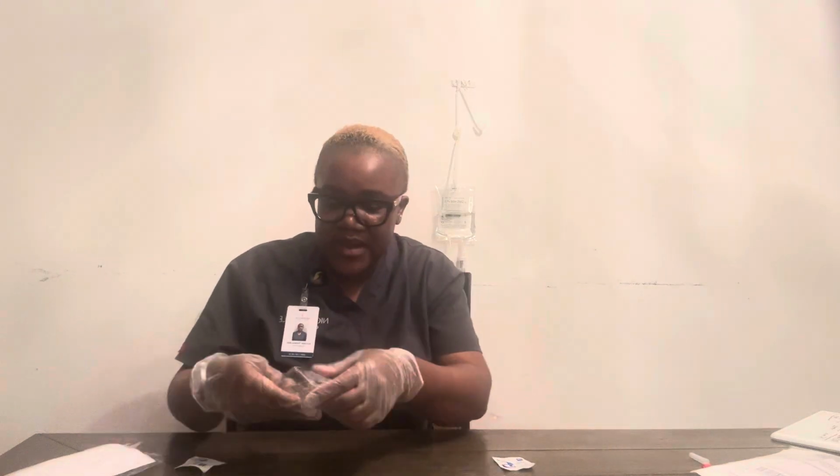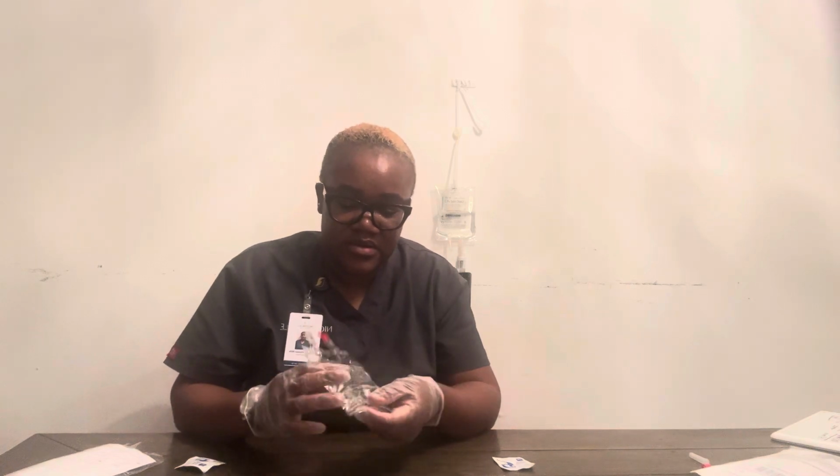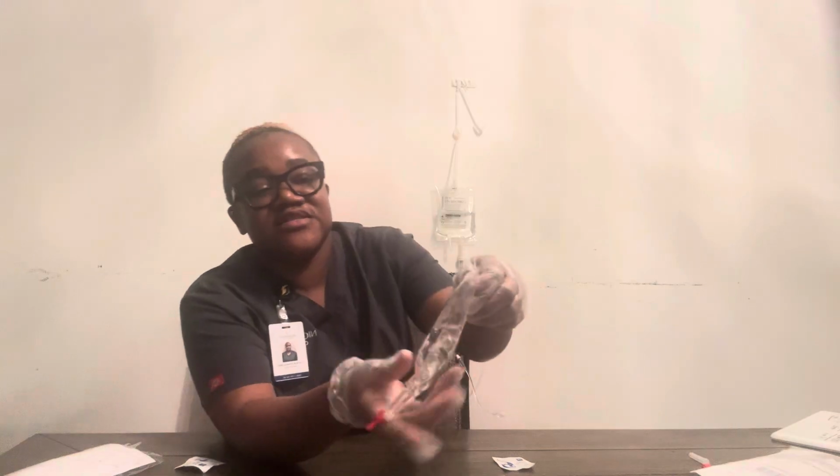All right, so next I'm gonna spike and prime my piggyback. Again, this is supplied in 100 ml.